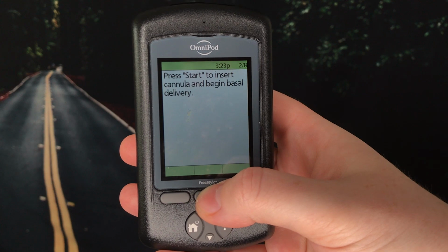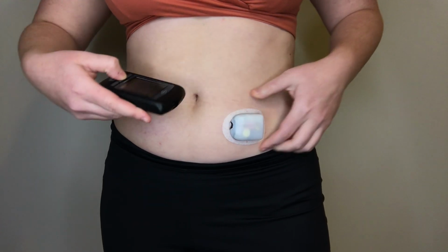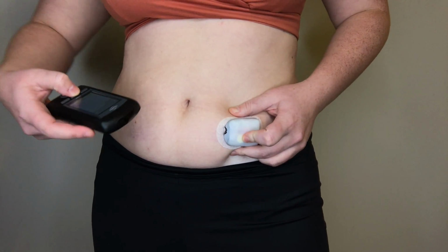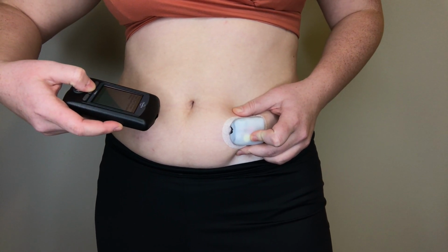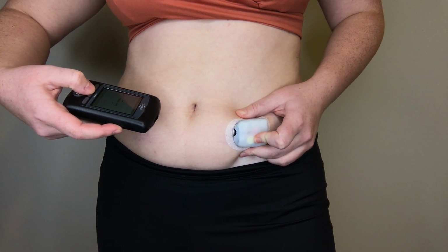When you press start to start the needle insertion, the needle will not go in right away. You're going to hear a few ticks first, and then it will go in. I like to pinch the skin around my pump and gently press down on the pod to add a little bit more cushion for the needle insertion.